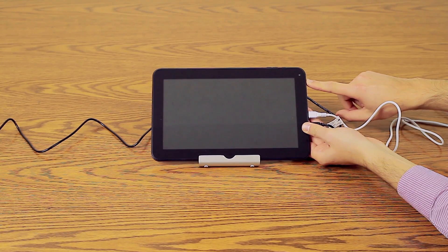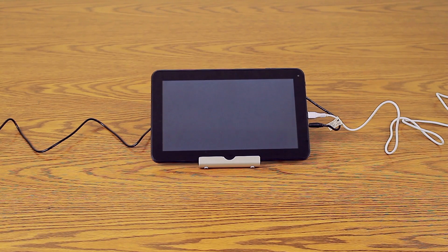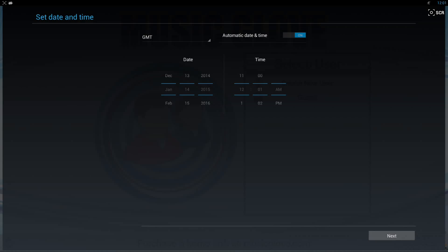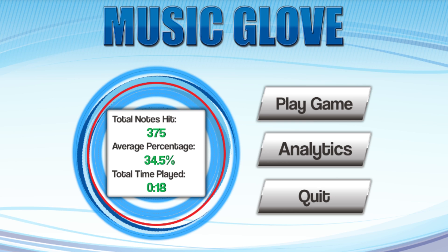Start the MusicGlove software. To do this, hold down the power button for five seconds and wait for the MusicGlove game to load. If you receive a reset clock warning when the game loads, select OK to set the date and time.